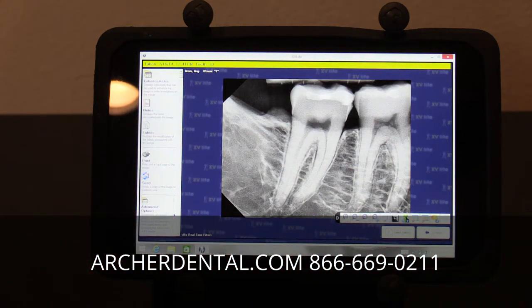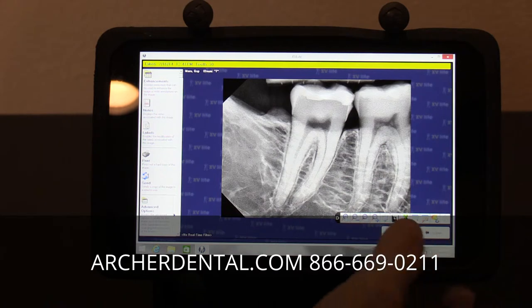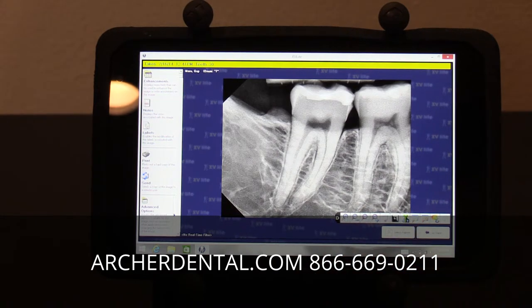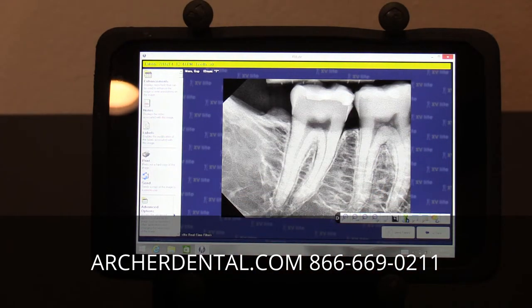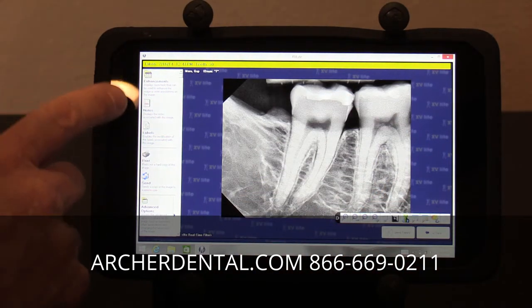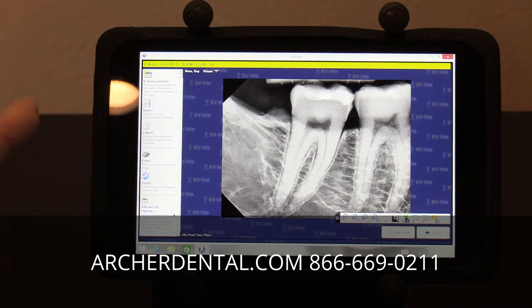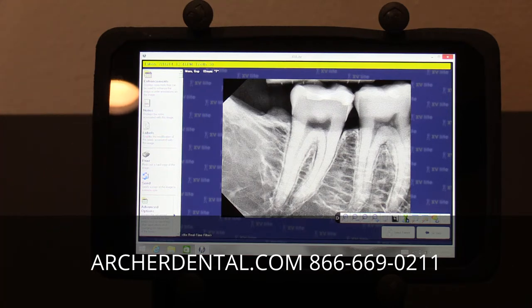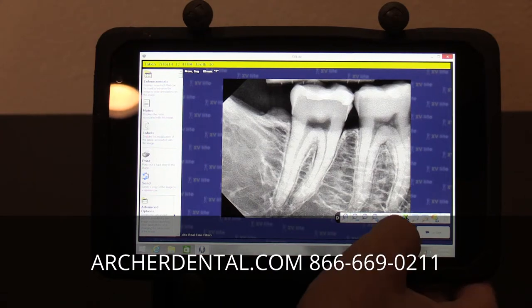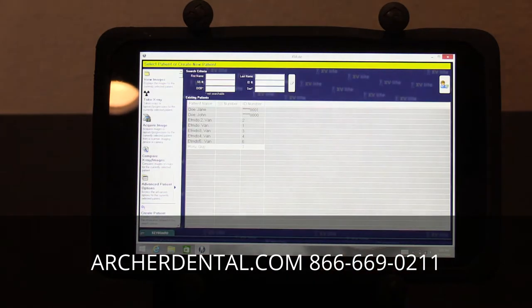From that point forward, you can modify the image and view it in different modes. You can save the image, email the image if you'd like to, save it in the patient file, or go back and take another image for a new patient.